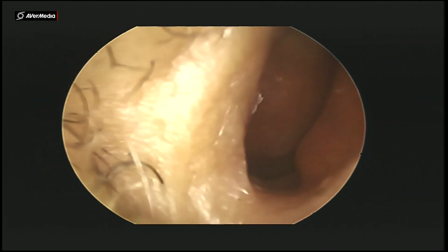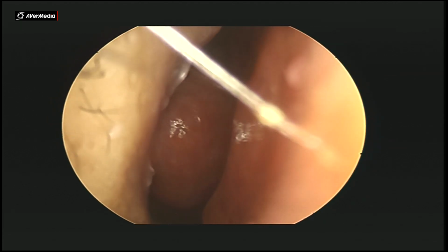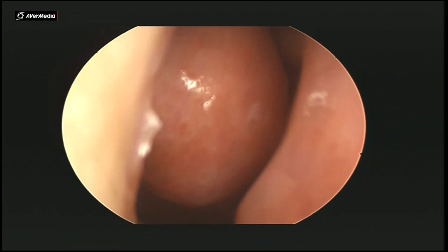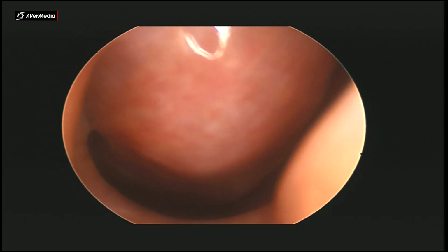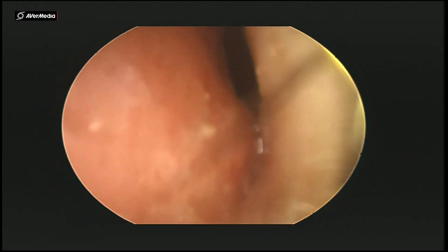So this is the patient's right side, and you can see in the center the septum is almost straight. You can see a little bit of mucoid streaks, and in the center you can see a huge swelling. That is the inferior turbinate, severely hypertrophied. So in case we can remove this patient's inferior turbinate around 90%, we can reduce that along with septoplasty.